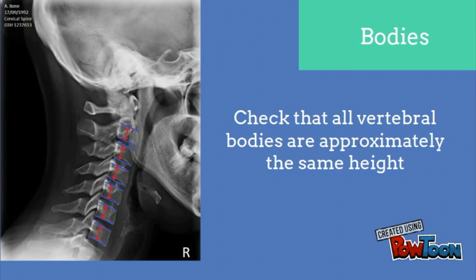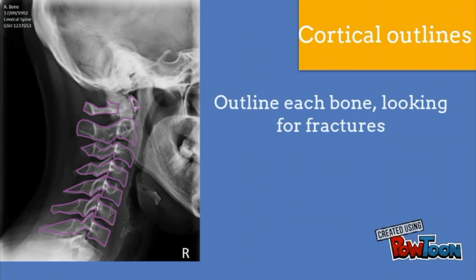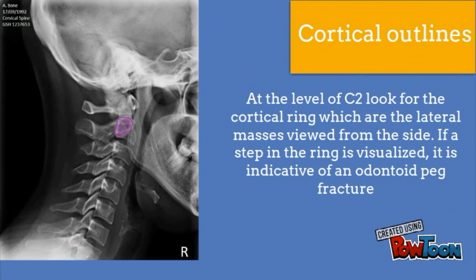Note that C1 does not have a body. Check that all bodies correspond to a spinous process. For cortical outlines, at the level of C2, look for the cortical ring, which are the lateral masses viewed from the side. If a step in the ring is visualized, it is indicative of an odontoid peg fracture.